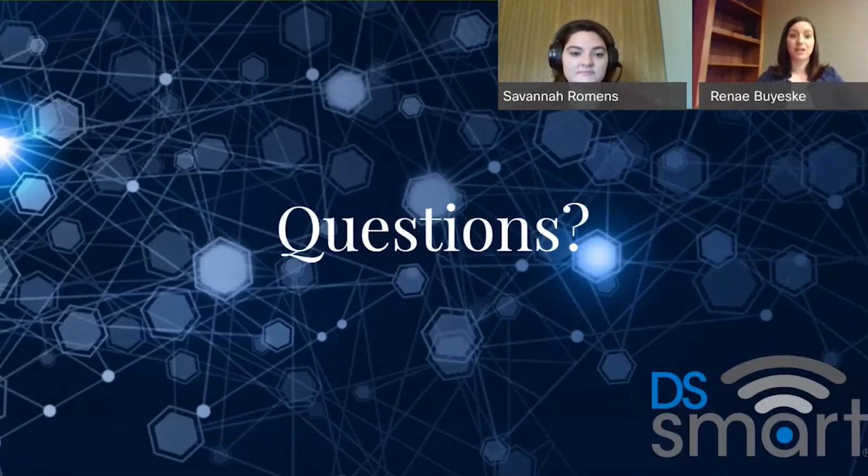Detecto Scales. So in general, if you recognize some of the models that you saw today, or you recognize some of the names on your equipment, a good first step is to just call and say, I see Detecto, I have a Detecto scale, and can you take it a level deeper for me, to understand if that's connectable or not.